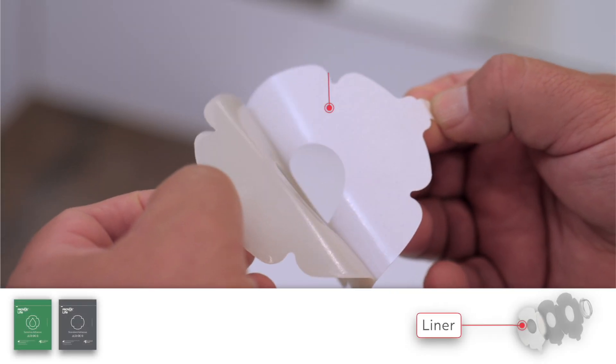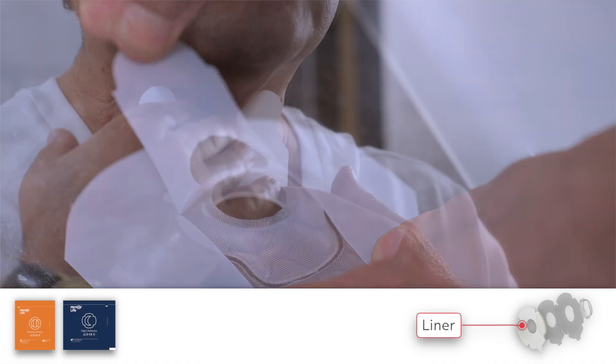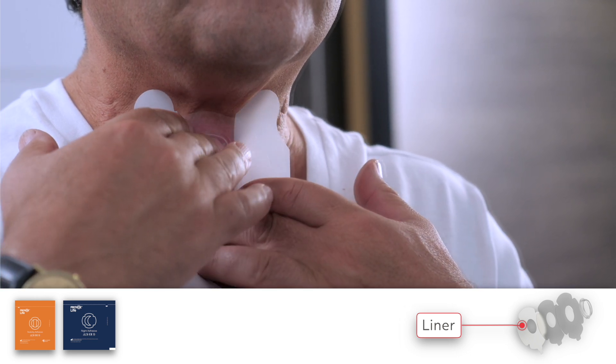The liner, also called the backing, is a paper or plastic layer that is removed before applying the adhesive base plate. Provox Life sensitive and standard adhesives include a one-peel liner for simple application. Provox Life stability adhesive and Provox Life night adhesive have a three-peel liner for stepwise application.